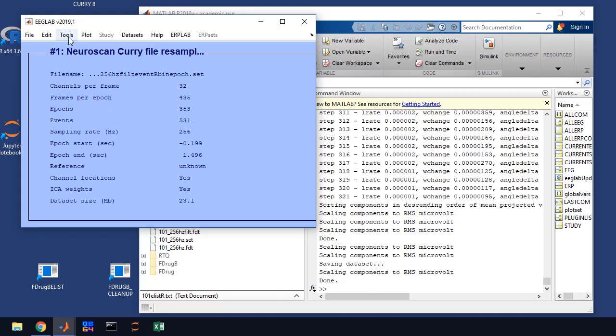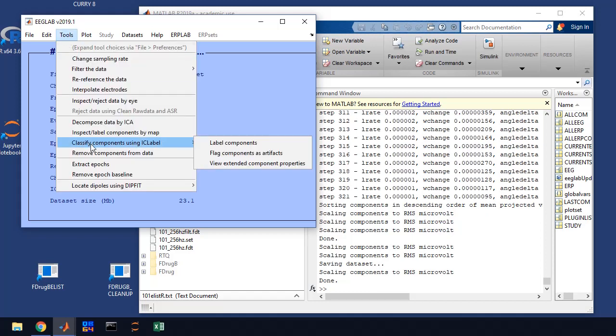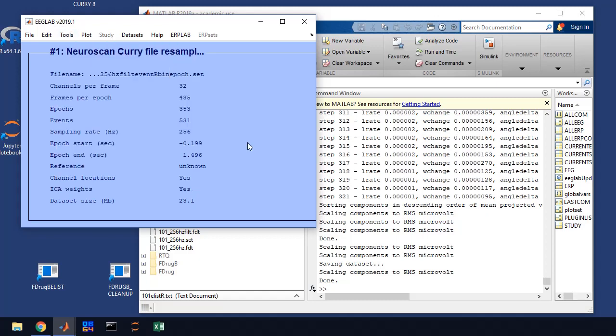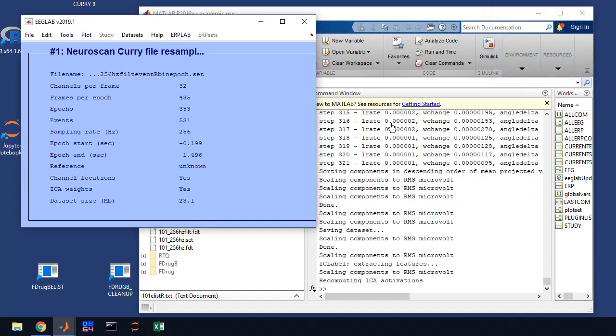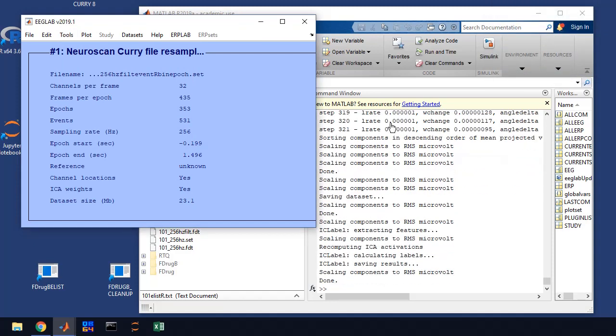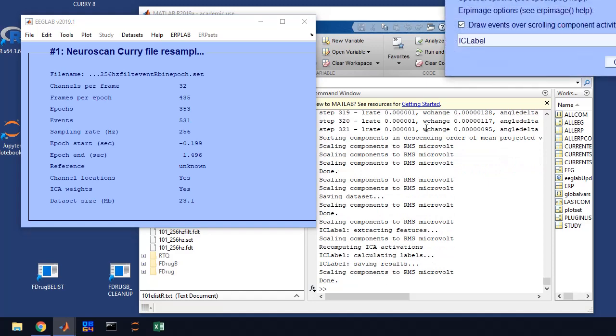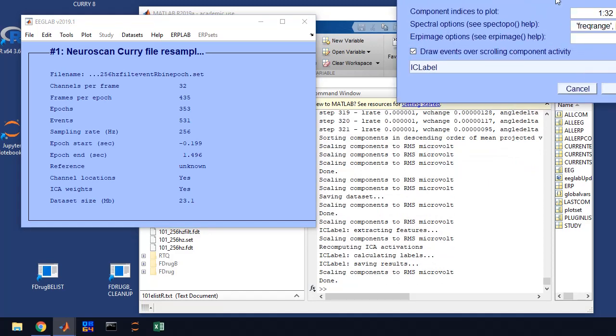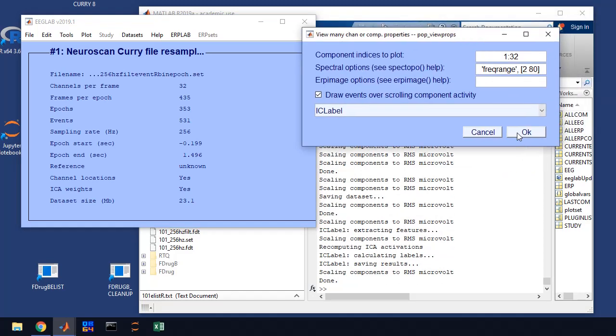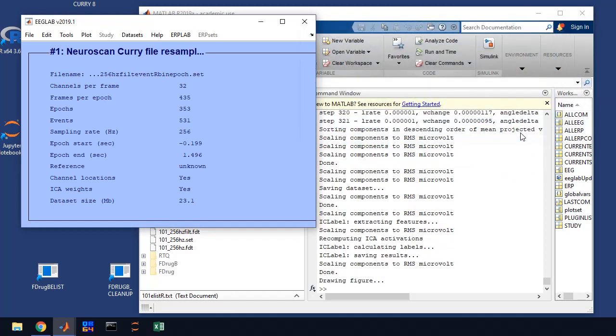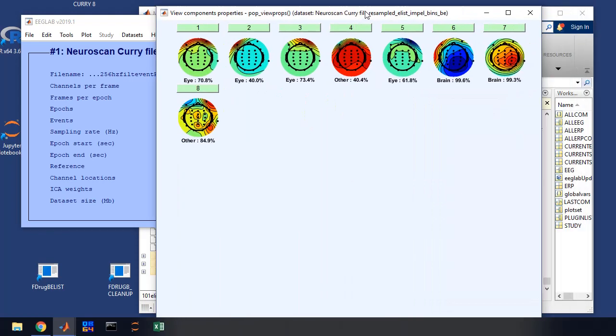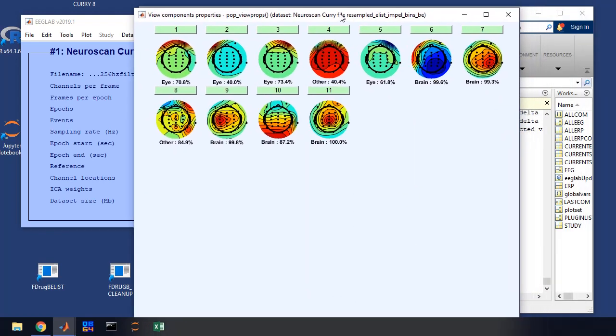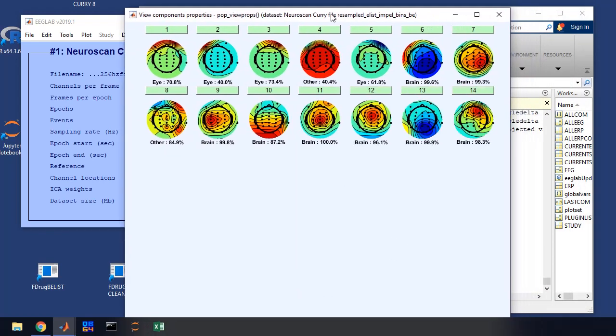So now the next step, what you want to do is go to tools and we're going to use IC label. It's an artificial intelligence that will look at our ICA components and tell us what it thinks is contributing to those components. And we just click on label components. You'll have the default recommended. You click OK. And it's going to come up with another window. You're just going to click OK.